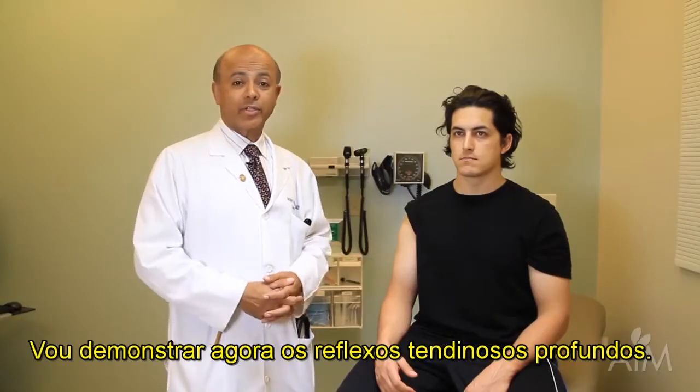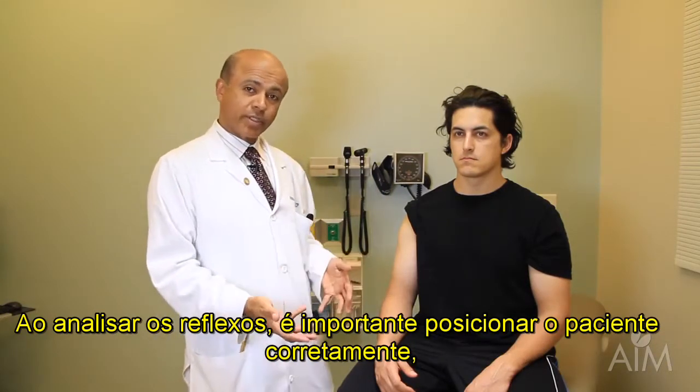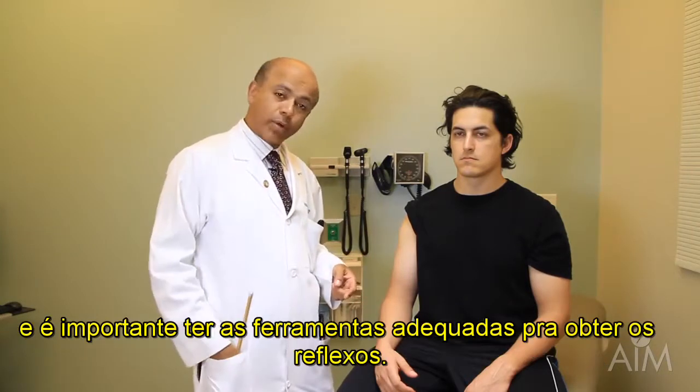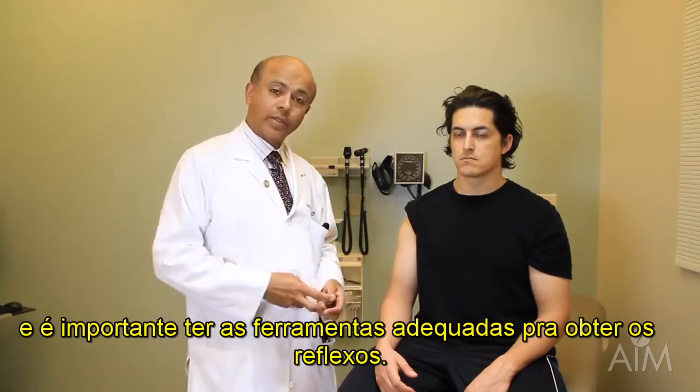I'm now going to demonstrate the deep tendon reflexes. In doing the reflexes, it's important to position the patient, it's important to know the level that you're testing, and it's important to have the right tools in order to get the reflex.